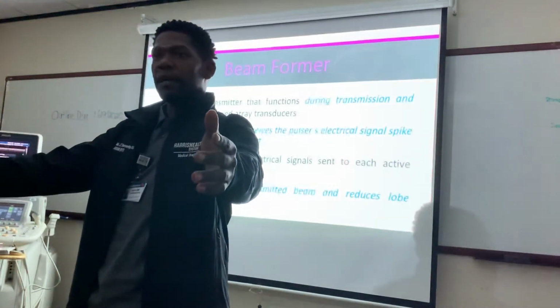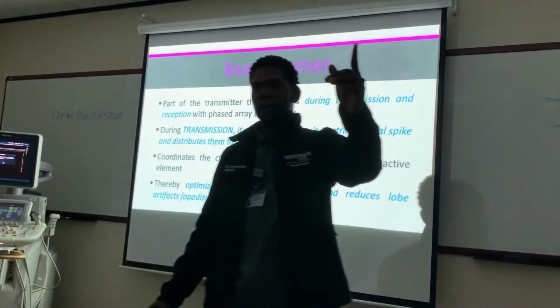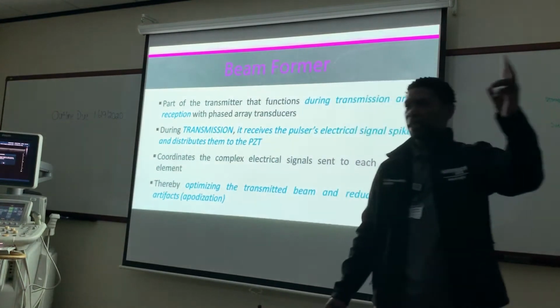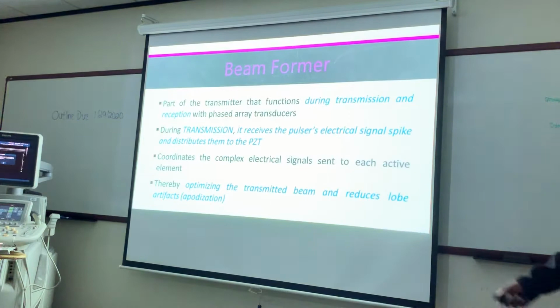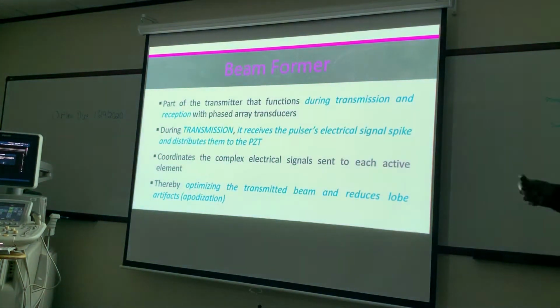A channel is made up of what, guys? A wire, system electronics, and the active elements. Okay? And like I said, it coordinates the complex electrical signals sent to each active element, therefore optimizing the transmitted beam and reducing lobe artifacts.